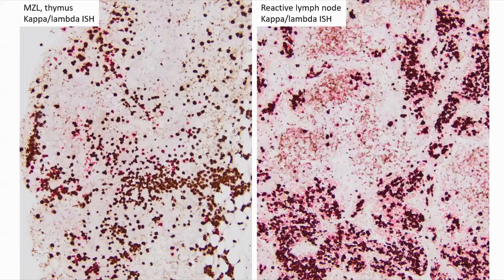Okay, so now delving into some of the small B-cell lymphoma subtypes. We've got our specimen here. We know it's probably got lymphoma.